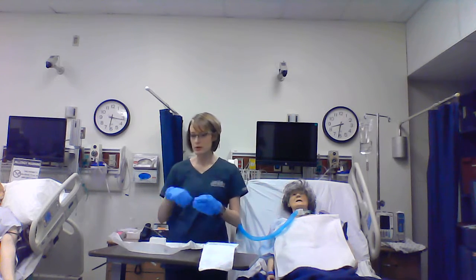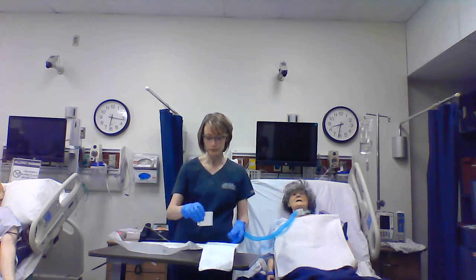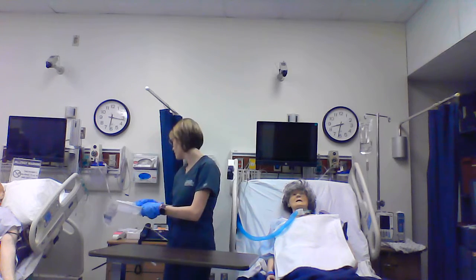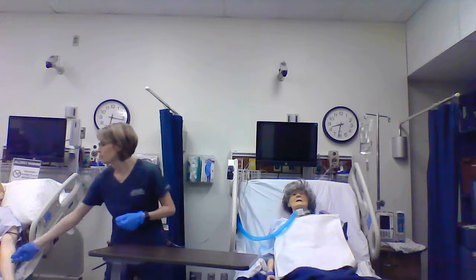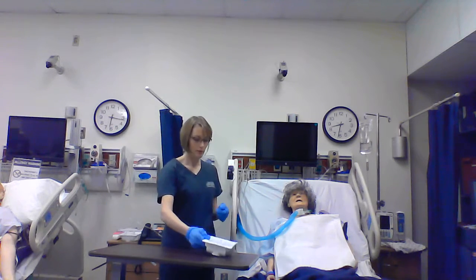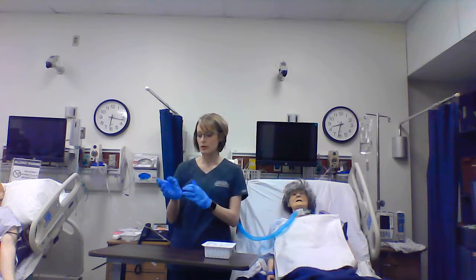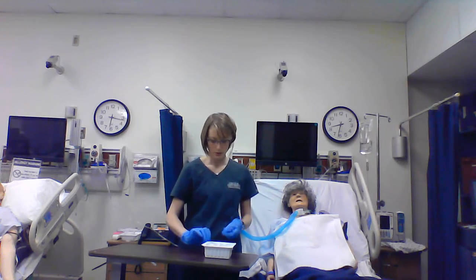So there again, I would doff these gloves, throw all my stuff away, and wash my hands again. So wash your hands. I'm going to grab my suction care kit, my tracheostomy care kit, and then I would have another set of sterile gloves to get ready to put on.